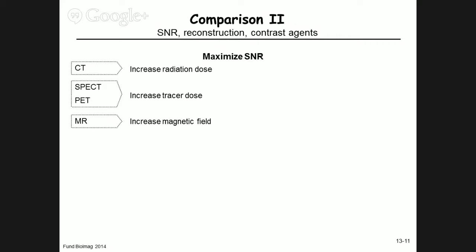But just to give you an idea, 30 years ago, it was thought it was impossible to do imaging at magnetic field strengths above 1.5 Tesla. 35 years ago, there was even a debate whether one could even image at 1.5 Tesla. Then 1.5 Tesla became in the clinic the standard of care, was the high-end magnetic field for magnetic resonance imaging for diagnostic purposes. And this is now increasingly being replaced by 3 Tesla, twice the magnetic field strength. And of course, there will be the question in a few years whether this will be replaced by 7 Tesla.